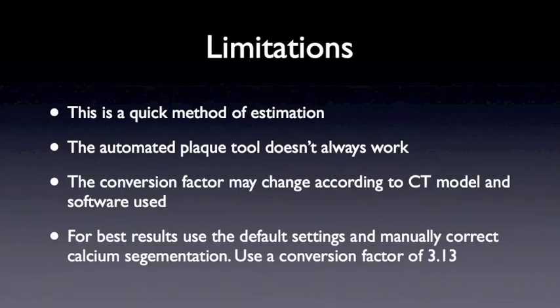Now there are limitations to this approach. What I'm presenting here is just a very quick and dirty method of estimating the calcium score. The automated plaque tool doesn't always work, and this conversion factor can definitely be contingent on the software that you use. For the most accurate measurements, you should keep everything at the default setting and manually adjust the calcium detection contours. You can then use a conversion factor of 3.13.